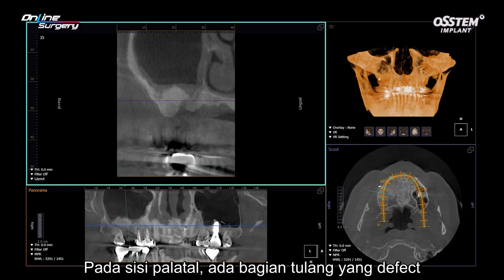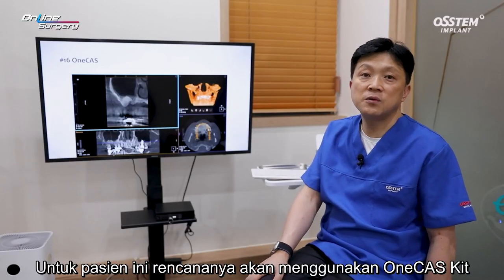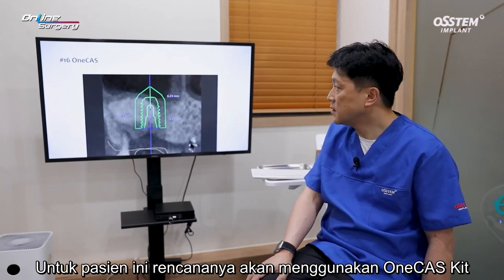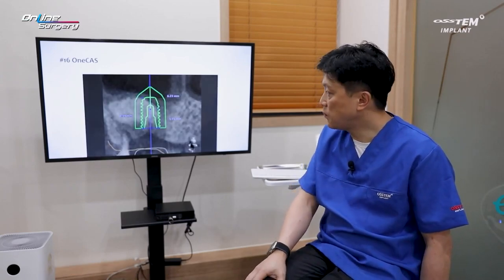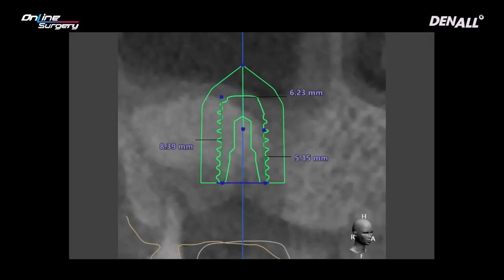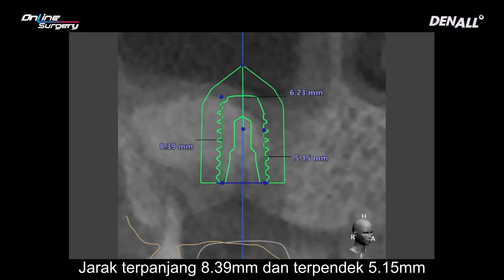On the palatal side, there is a slight bone defect. The plan was to use the OneCAS Kit for this patient. In the surgical report, when you measure using CT, the implant was positioned virtually. The mesial and distal distance to the sinus differed significantly. The longest distance was 8.39 millimeters and the shortest was 5.15 millimeters.